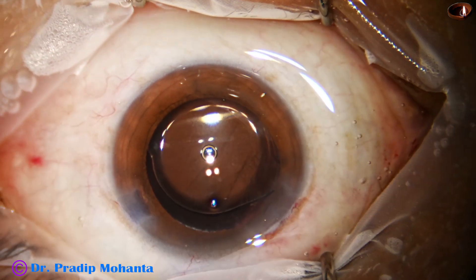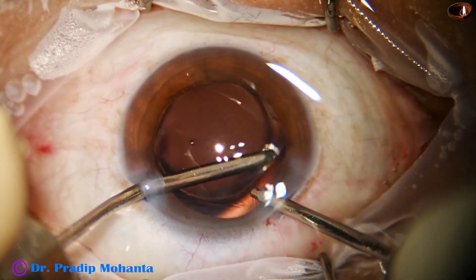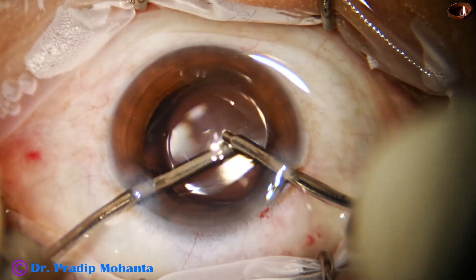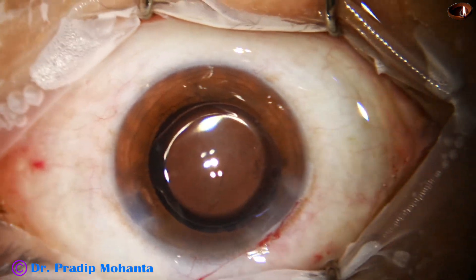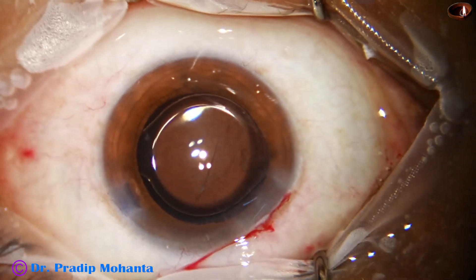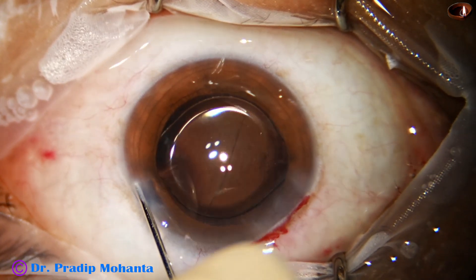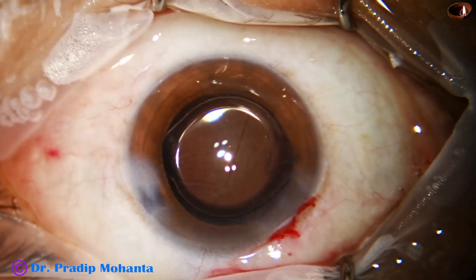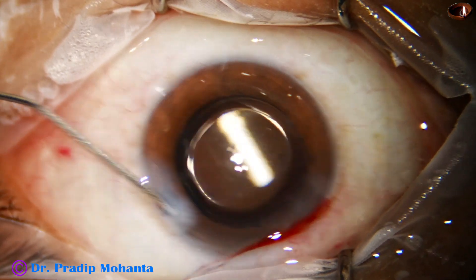Now there is clearance of some cortical matter that was present sub-incisionally — some cells were there and have been removed. This is a bit of moxifloxacin. Now the side port is being hydrated — the corneal stroma at two sides of the side port is being hydrated so that the side port closes.